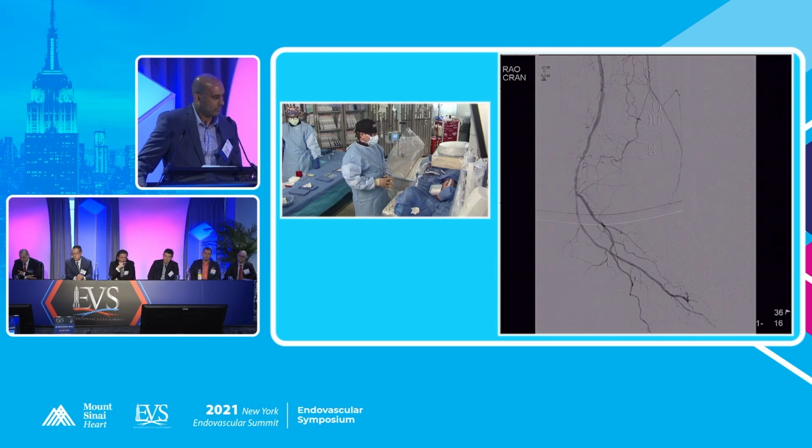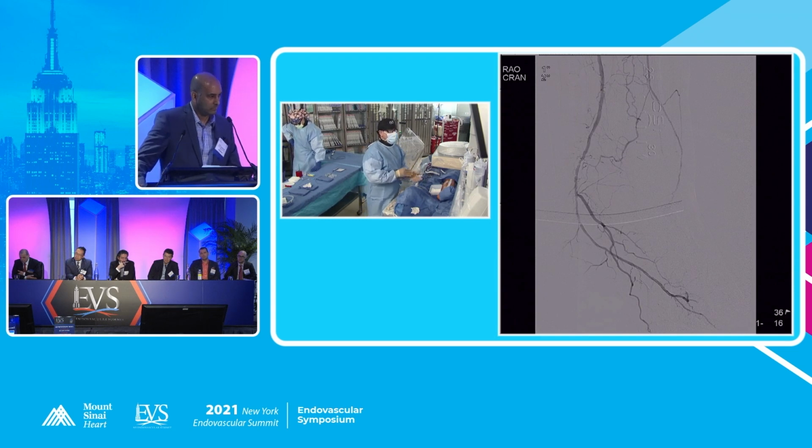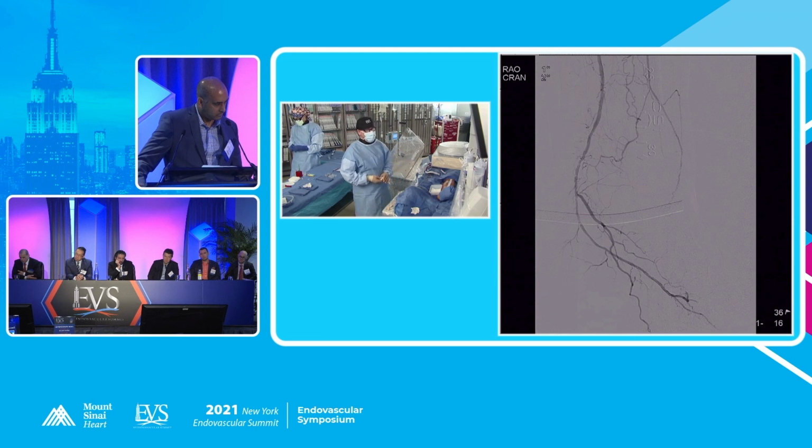So let me just stop for a moment and see. We had other options ready. We had a 7.5/30 Supera interwoven stent for the common femoral artery, or a 3.0 or a 3.25 drug-eluting stent for the distal posterior tibial artery. But given some of the very astute comments, especially from our surgical colleagues at the beginning, I think right now we've done what we set out to do.